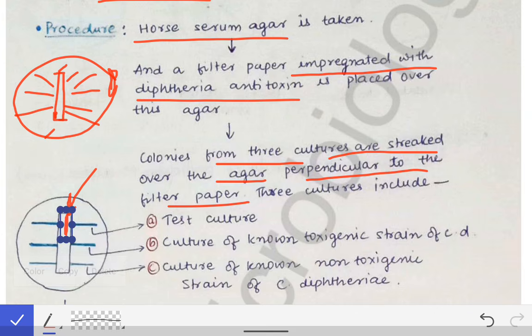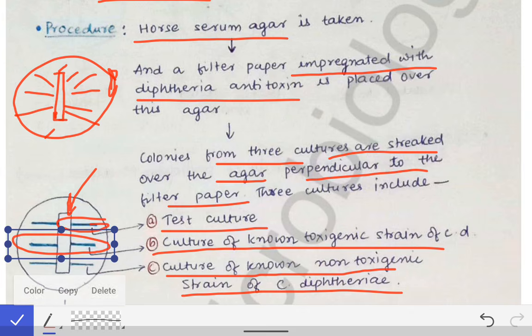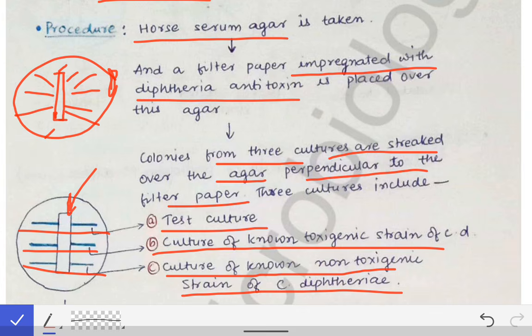Okay, so what are those three cultures? One is the test culture. I have streaked this test culture. Then the culture of a known toxigenic strain of Corynebacterium diphtheriae, which is this one. And then a culture of a known non-toxigenic strain of Corynebacterium diphtheriae, which is this one. So in this way we will streak from the three cultures: the test culture, which is the above one, then the culture of the toxigenic strain and the culture of the non-toxigenic strain.